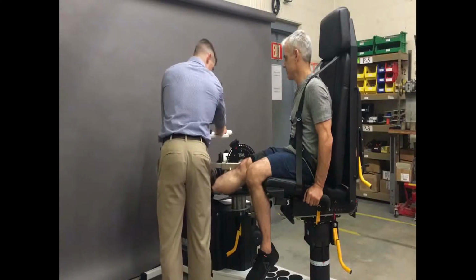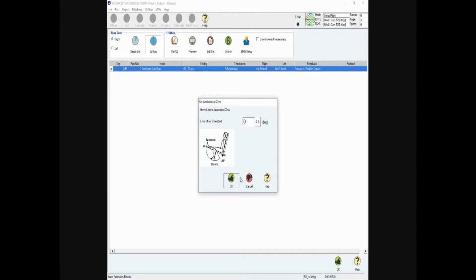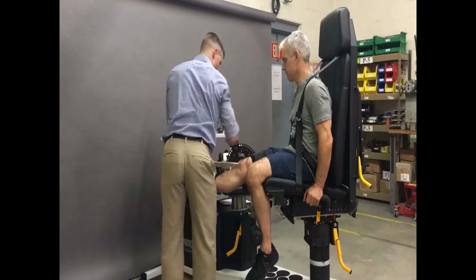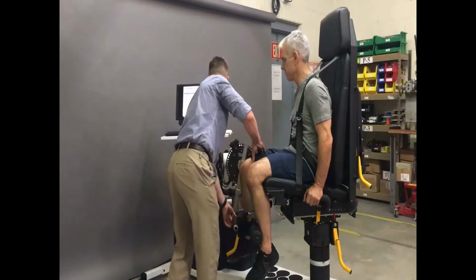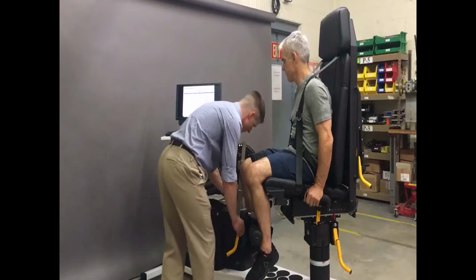So if that athlete starts out their first 3 or 4 reps and then they really figure out what they're doing and they're picking up the intensity, that's not going to give you a good measure of their fatigue. So you only get a good measurement of how they actually fatigue if that athlete truly understands what to do in the test and they really explode out the gate.